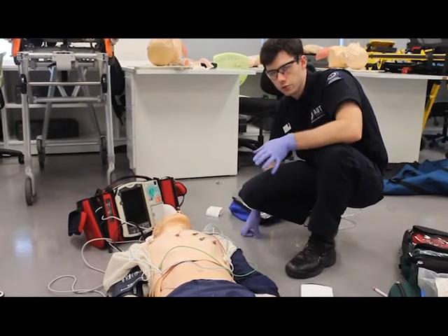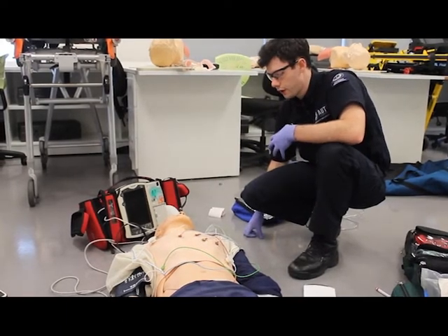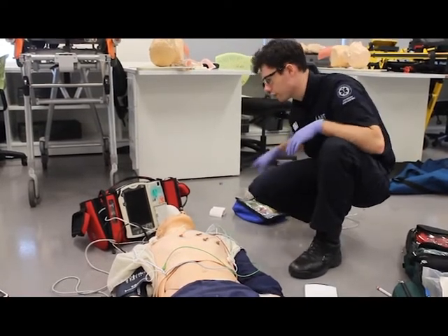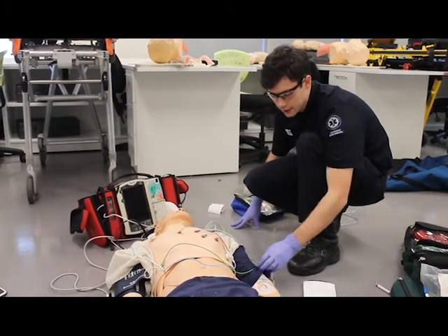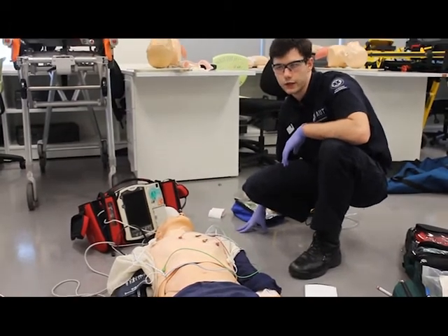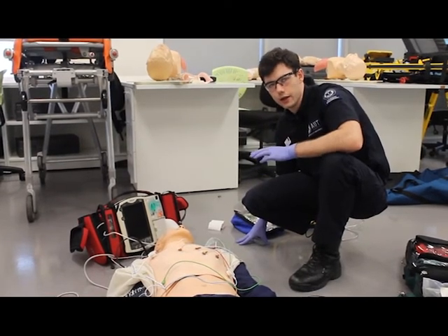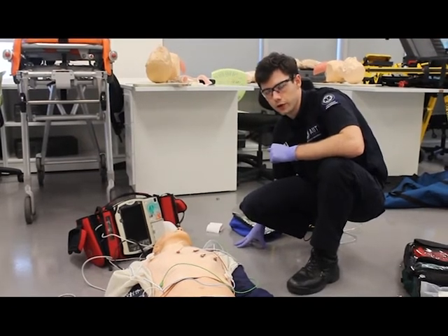Another thing to make sure we do before we cardiovert is prepare in case Bob cardiac arrests, so that we have our resuscitation gear all set up. We've got our bag valve mask, we've got our suction, we've got our defibrillator, we've got our kit. We've also gained IV access for administration of drugs in the case of cardiac arrest, or for potential chemical or pharmacological cardioversion if we're unsuccessful with our defibrillator.